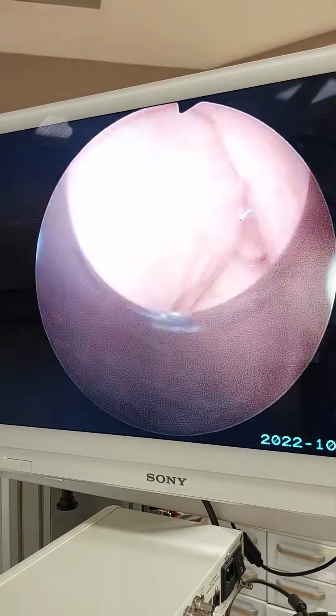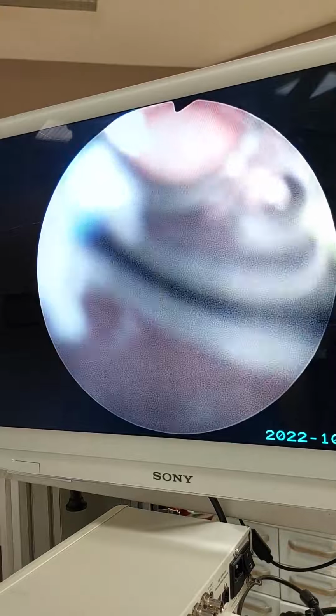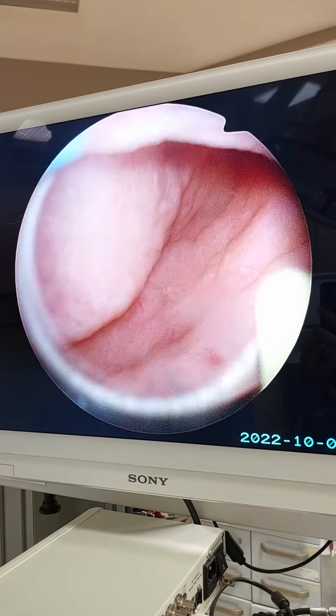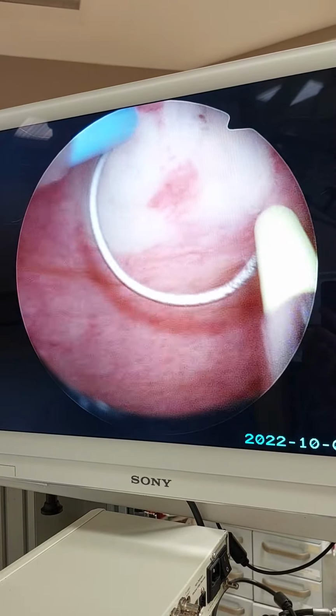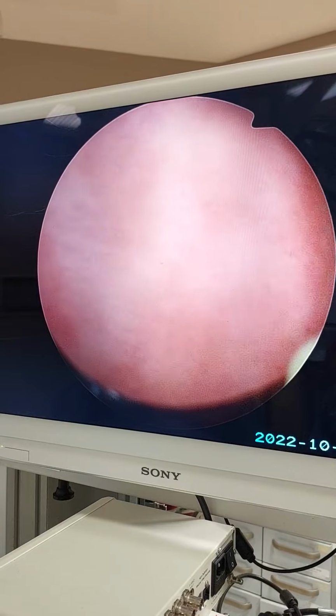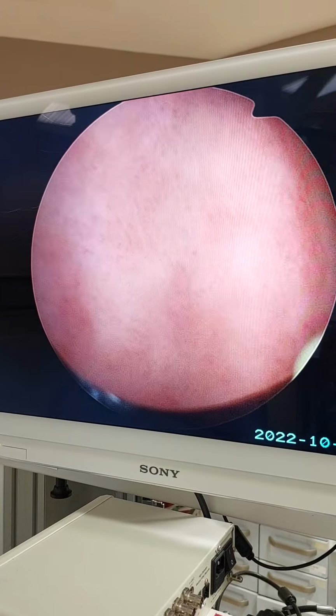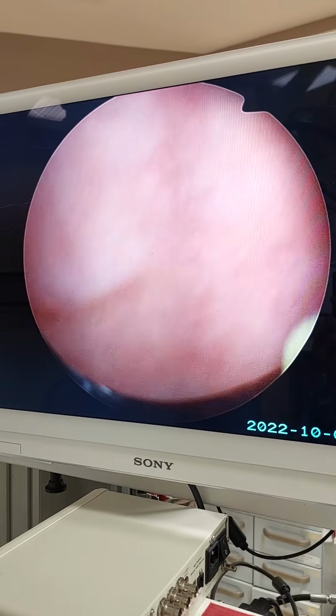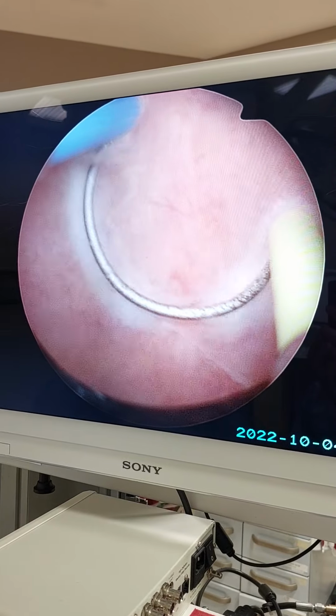And additionally, the upper wall of the bladder now seemed to me a little inflamed. This is also coming into contact. This part is coming into contact with this and trigone. So this part, you see, the mucosa is changed. You see the difference? This is not a normal mucosa. So the inflammation may pass to this part.